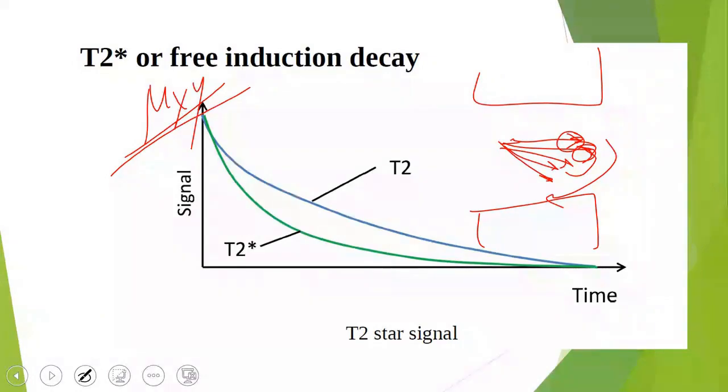So now I have a challenge with maintaining homogeneity, what I call the magnetic field's stability. Okay, the homogeneity or stability effect on protons, I want to eliminate it, so that my image depends only on the T2 constant of the tissue of the water, not on the diffusion that occurred.